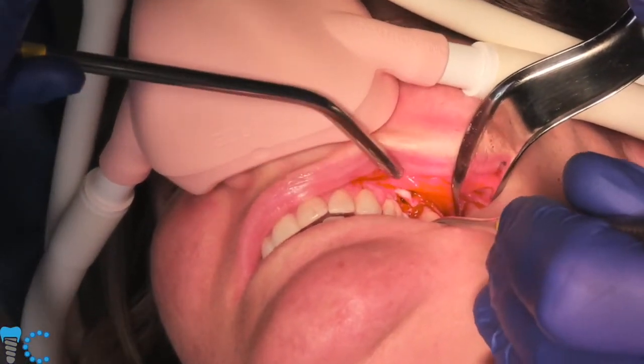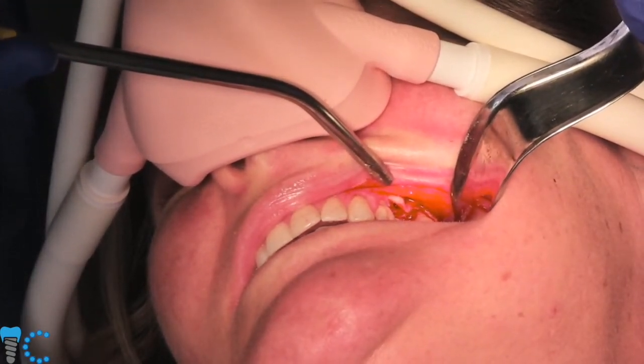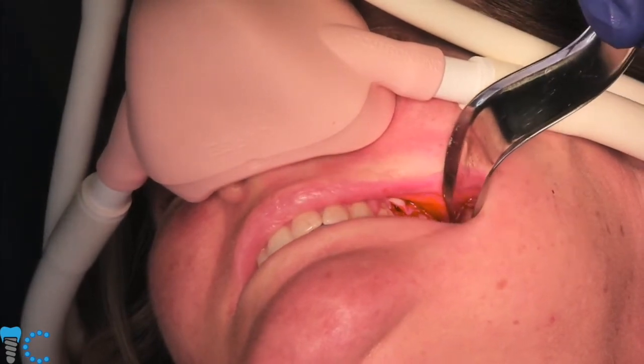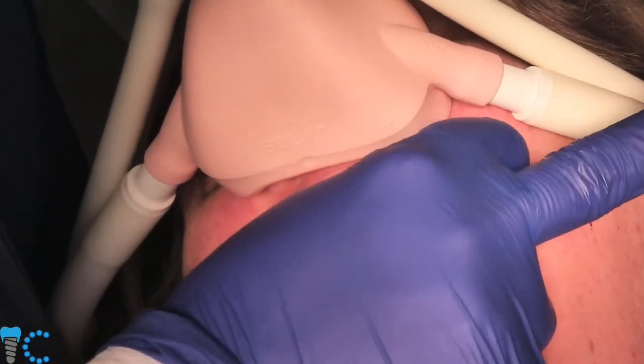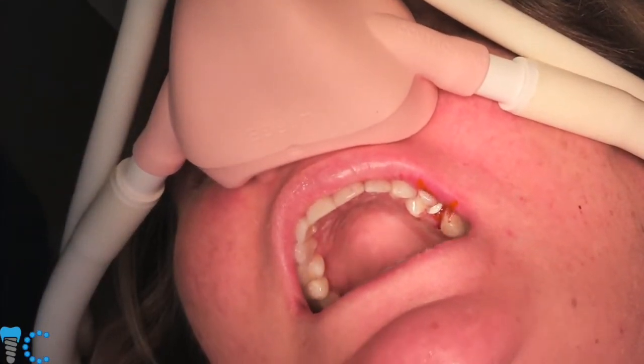All right. Very nice. There we go. It's exactly what we're shooting for. Great job. Can't beat that. About how many of these ceramic implants have you personally placed? Oh, 1,000 and change. Wow.